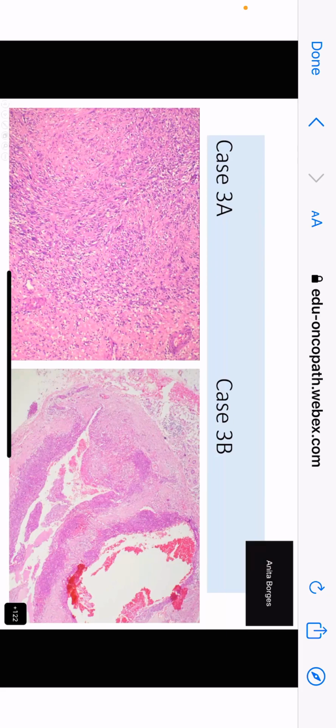Okay, so you have got fascicles. Maybe there's a little bit of a herringbone pattern over there. But you were absolutely right. There are areas which have got clear cells and others that are frankly spindly. On the right hand side, you see something else. And what is that? There is a condensation of cellularity around that lumen, ma'am, around the spaces. Spaces filled with blood. Very good.